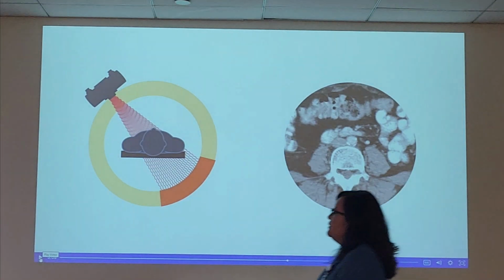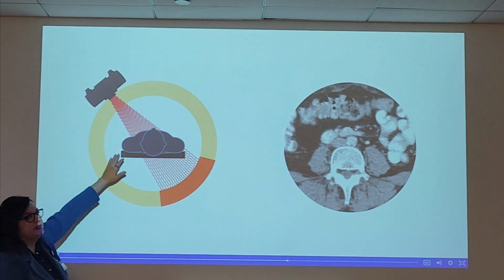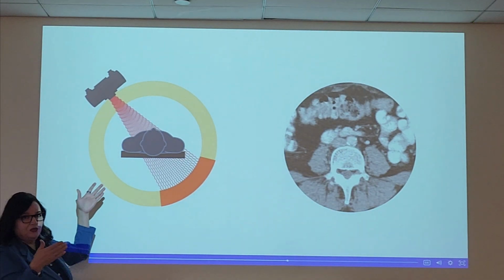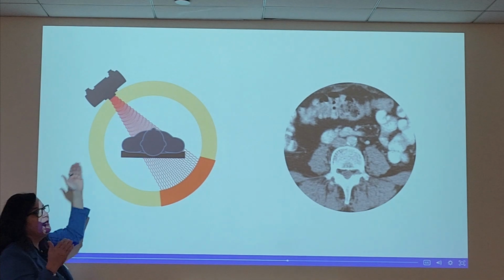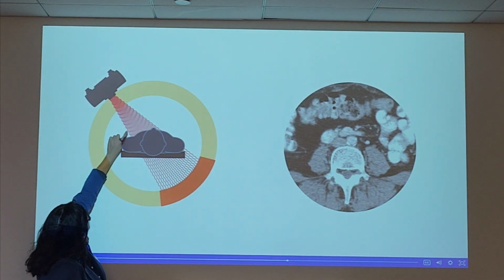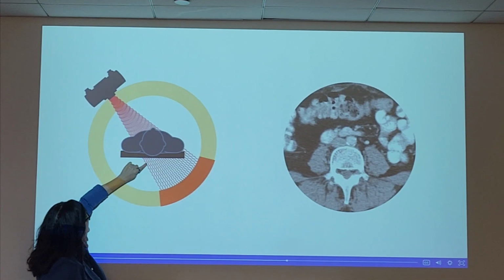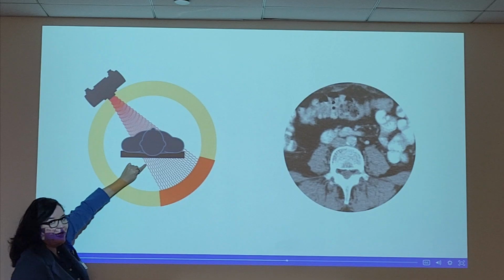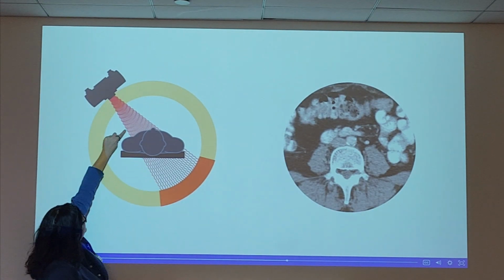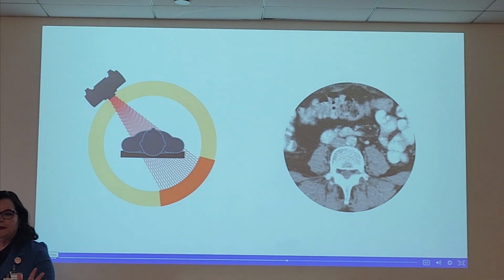So, as the radiation is being aimed at the patient, because we can't move the patients anywhere else other than the table, we set them on the table. The table's pretty narrow to fit into that gantry space. So we aim at the patient. Look at the differences between this wave entering the patient. We know that something is happening. And look at the wave frequency afterwards. What's the difference between this wave and this wave, based on what I just said?